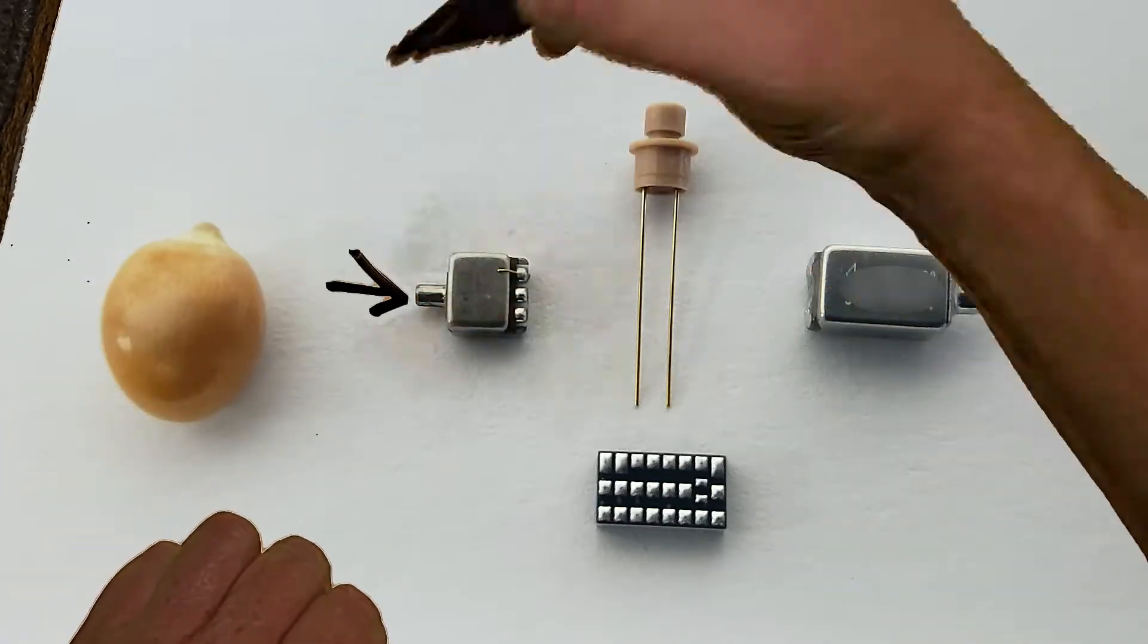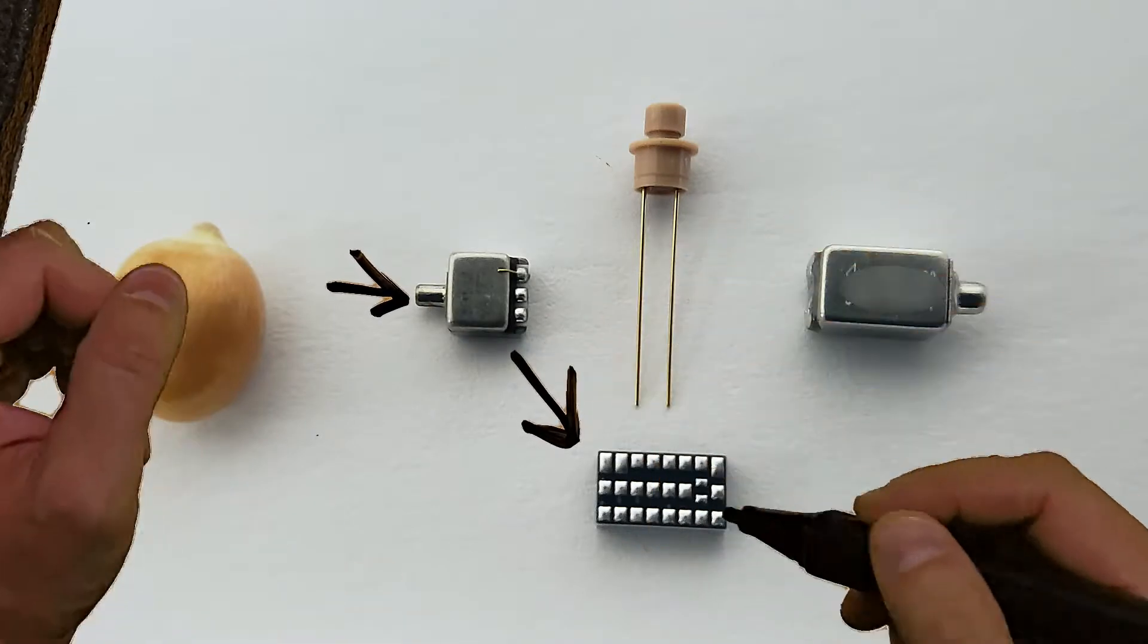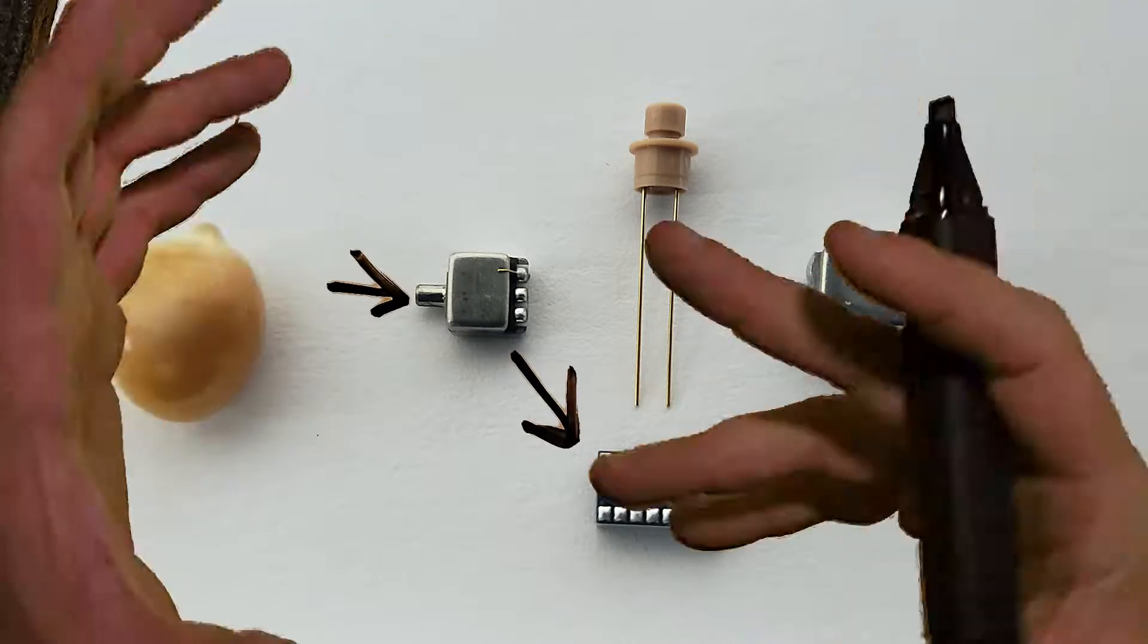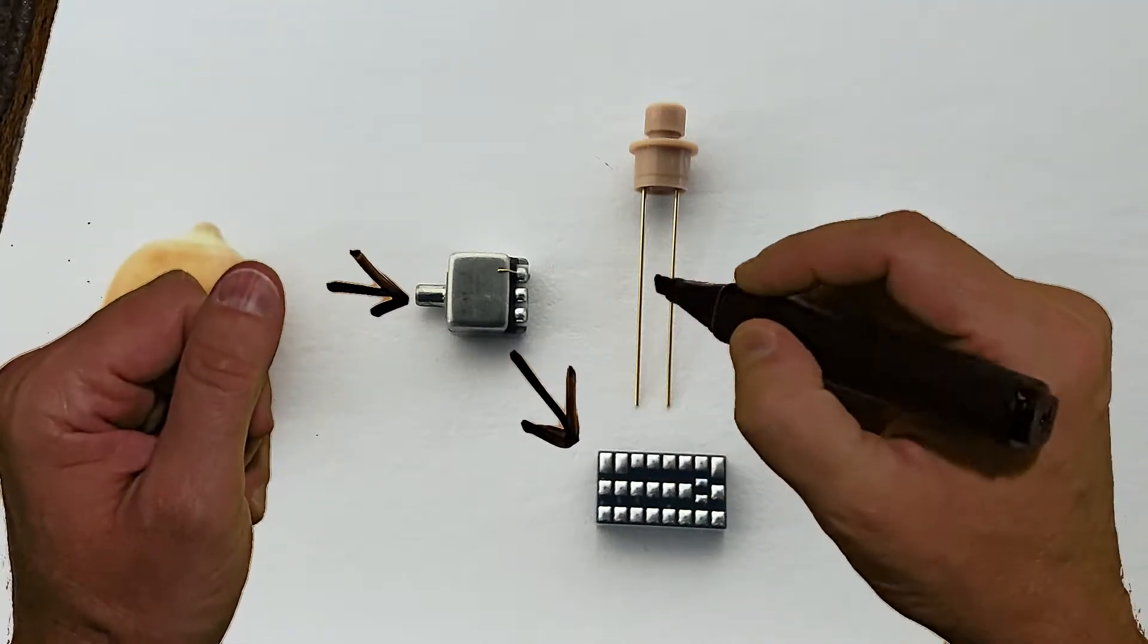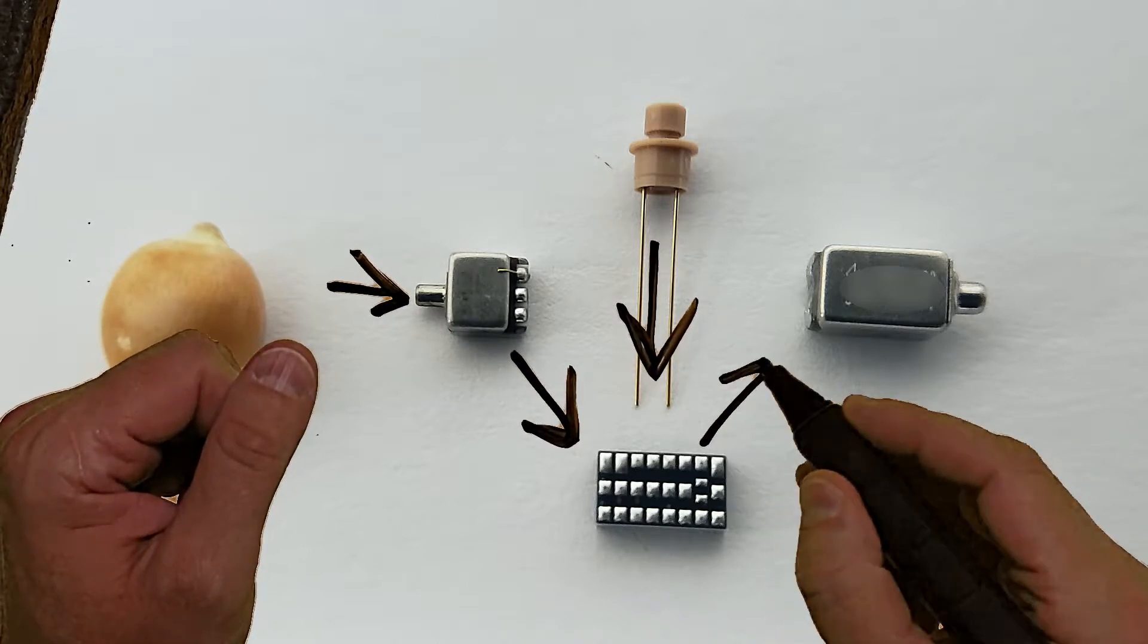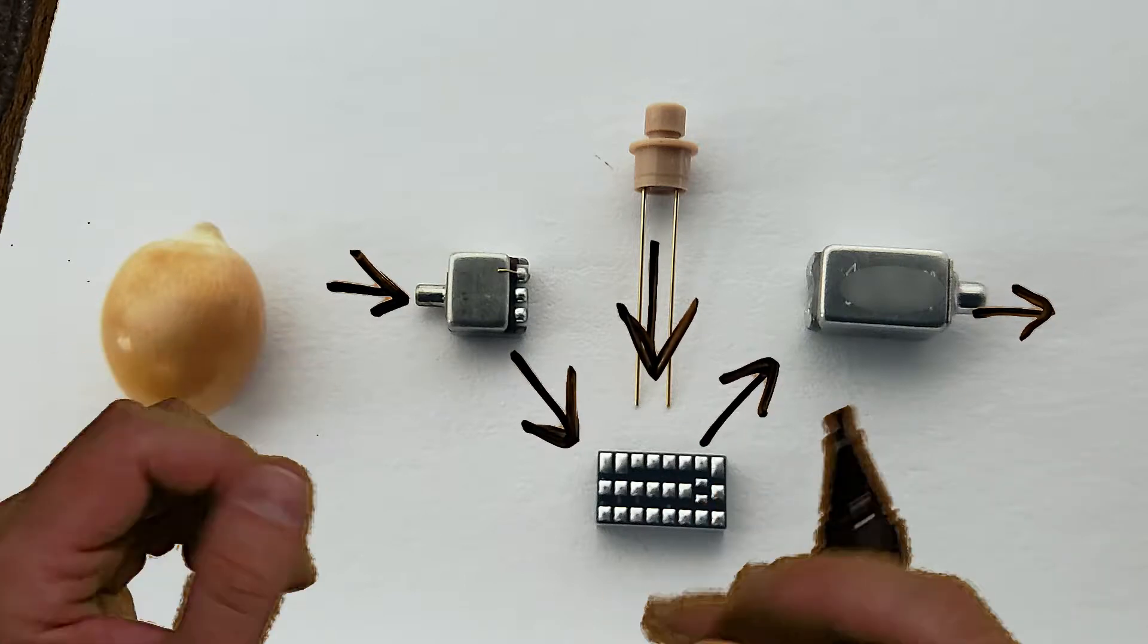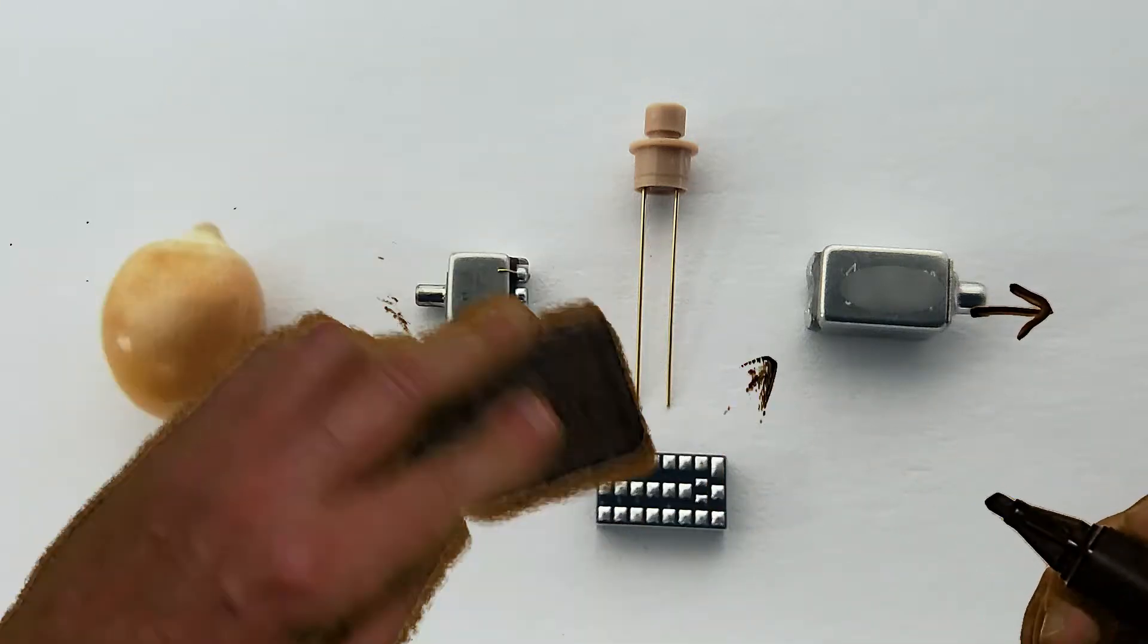The microphone takes sound from the outside world and sends it to the digital processor, which adjusts its frequency range or volume. You may or may not have a control to adjust the volume. From there, it sends the signal to the speaker or receiver of the hearing aid, which sends it out to your eardrum and helps you hear better.